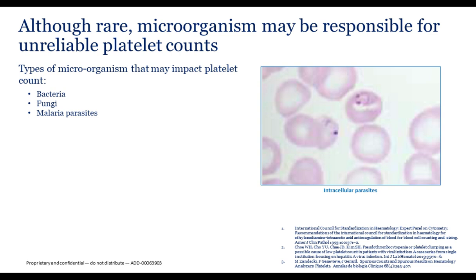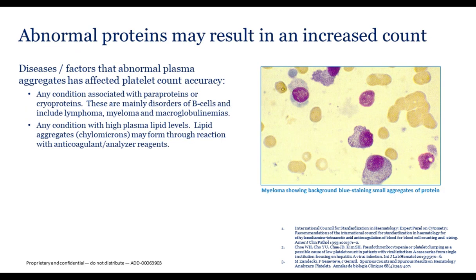Although rare, microorganisms may be responsible for unreliable platelet counts. In smear review, intracellular parasites — such as malarial parasites — can be seen. As red cells hemolyze, the parasites may become free and falsely increase the platelet count. Abnormal proteins may also result in increased counts; diseases associated with paraproteins or cryoproteins — including lymphomas, myeloma, and macroglobulinemia — can impact many platelet counting methods, especially the impedance platelet count.